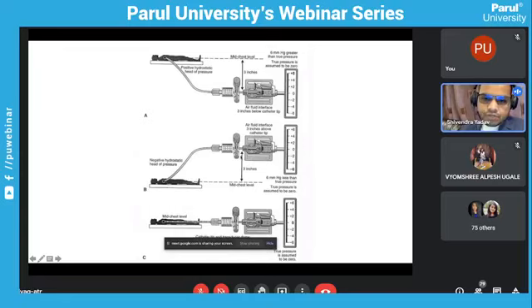And if you place a transducer above the mid chest level, then you will get a lower pressure, at least 6 mmHg to 10 mmHg lower, because there is a negative hydrostatic head of pressure. The fluid takes a lot of time to reach this transducer, hence it requires some pressure, and that pressure is reduced because of this line. That is called negative hydrostatic head of pressure.